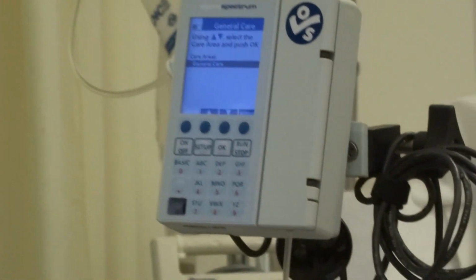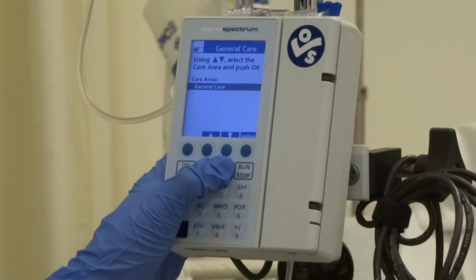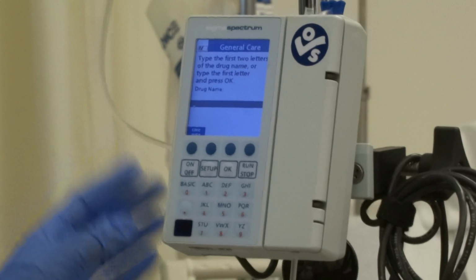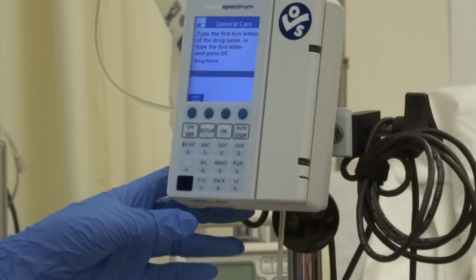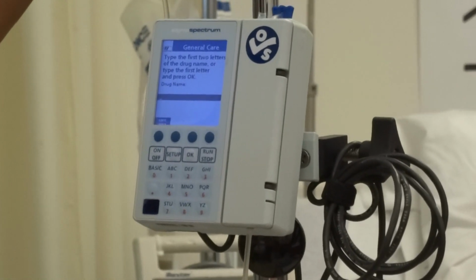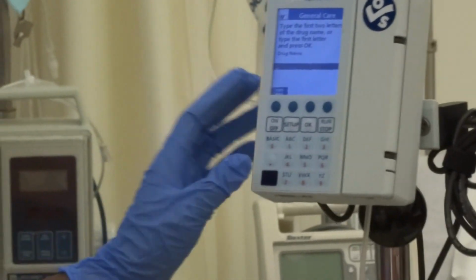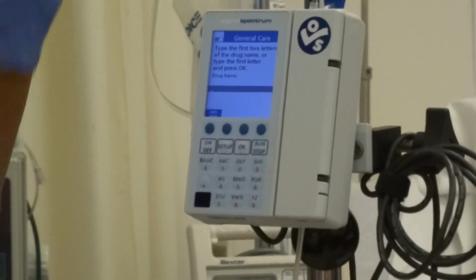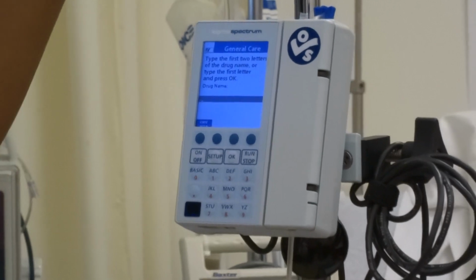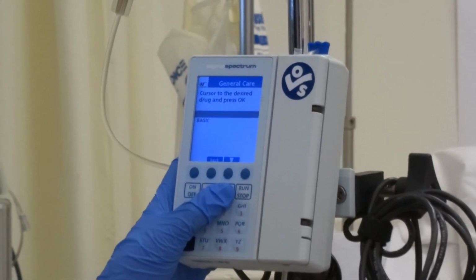So when you get to the floor, it's gonna say what floor it is, okay? And if this is a normal saline, typically what you're gonna want to put in, which you guys might already know, is IV. Then you need to choose the right normal saline, because there's 0.45 and then there's 0.9. So make sure it's just whatever you're giving and it's not any add-ins either, because some medications even have potassium in them as well. So in this case, we choose 0.9 IV, select it, push OK.